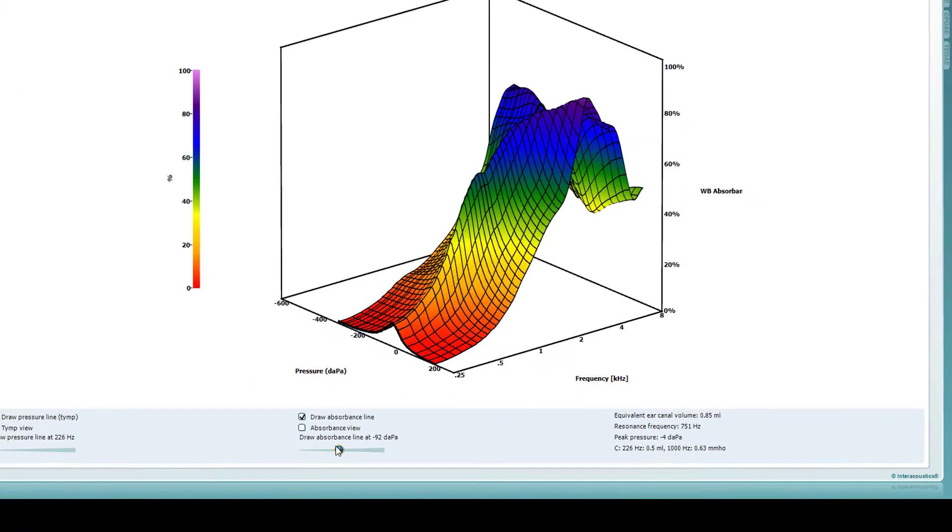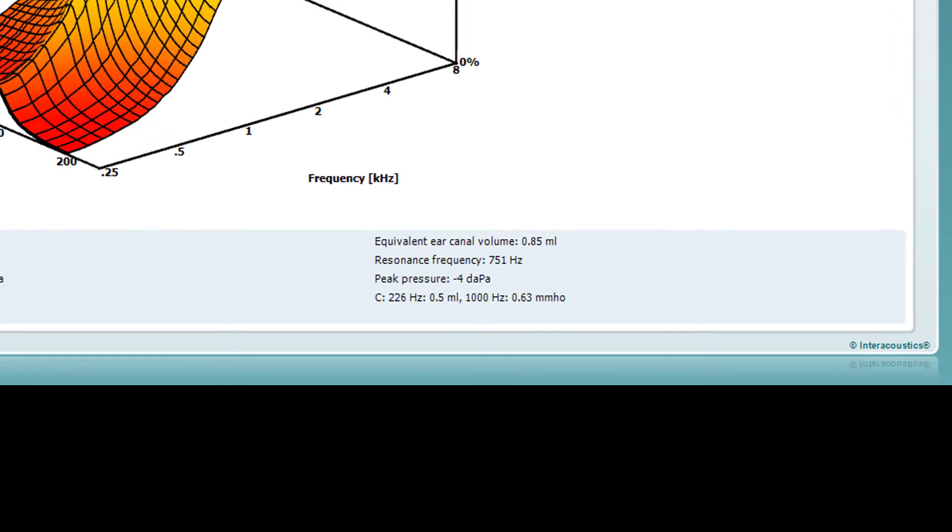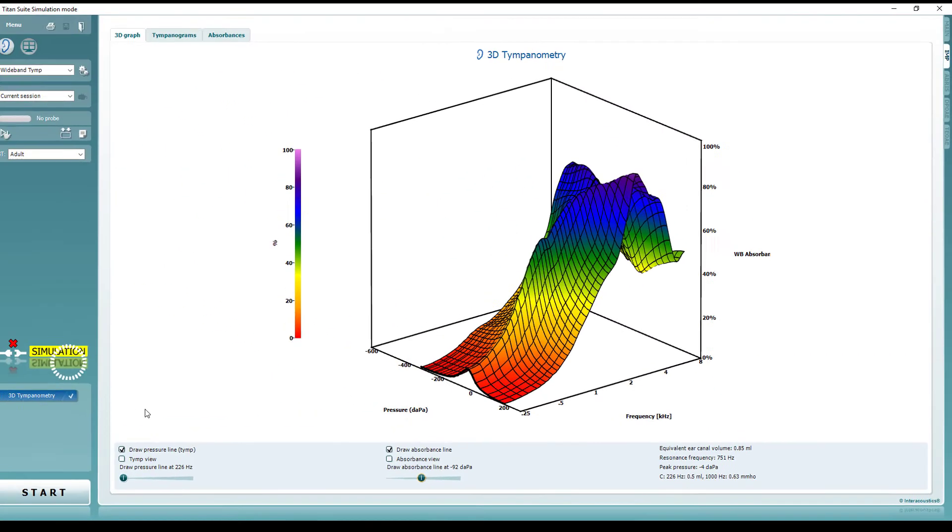The ear canal volume, resonance frequency and peak pressure values are also displayed.